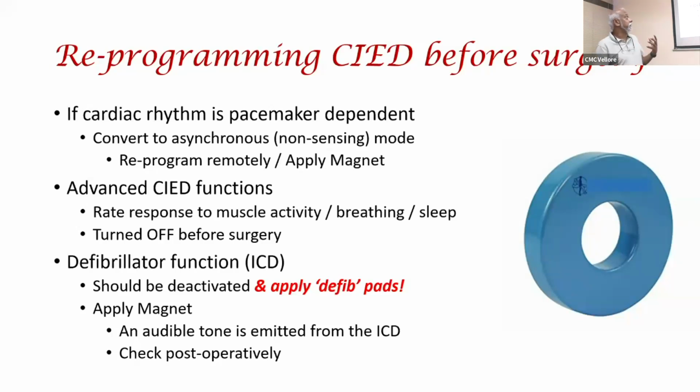Now, one of the things you have to be careful about: these advanced cardiac implantable devices are very intelligent, especially when they change their rate with exercise, sensing muscle activity or when the patient is asleep. So that modality should be turned off before surgery. That is done remotely by a programming device.